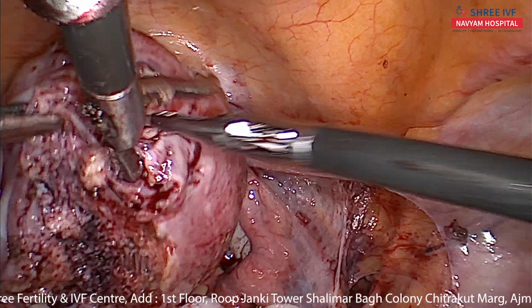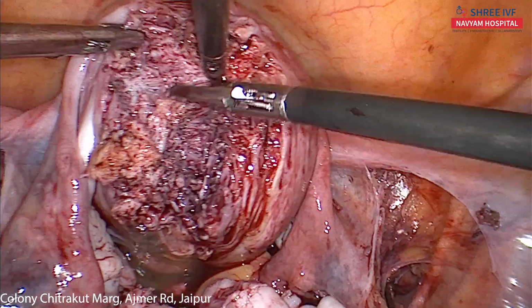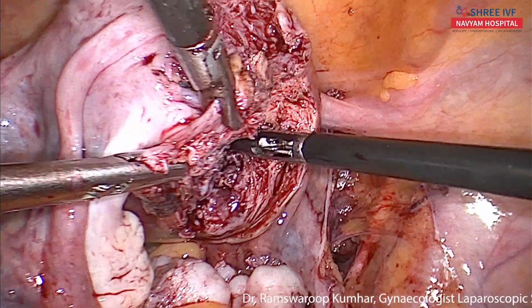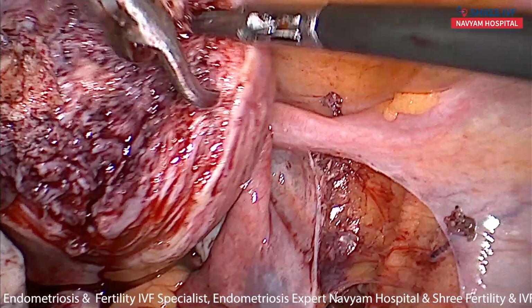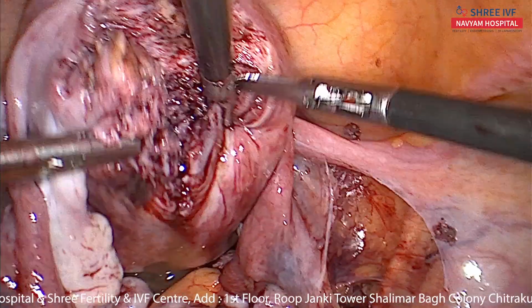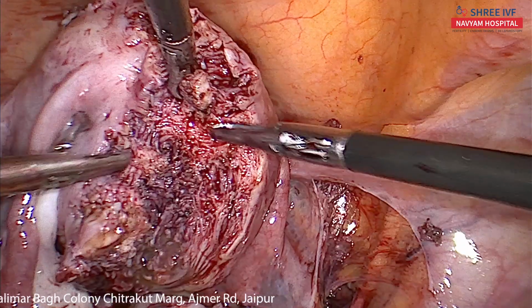Okay, all clear? Tanush sir, all clear? Do you think any more slightly larger myoma is remaining? I think millimetric size myomas are remaining inside, but they will autolyze because we have done the bilateral uterine artery ligation.